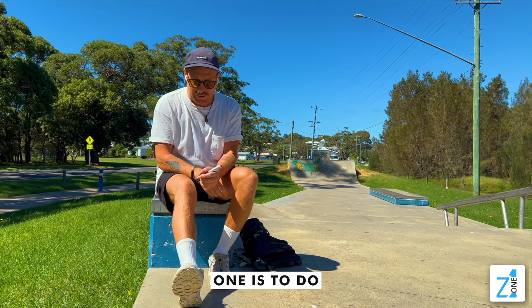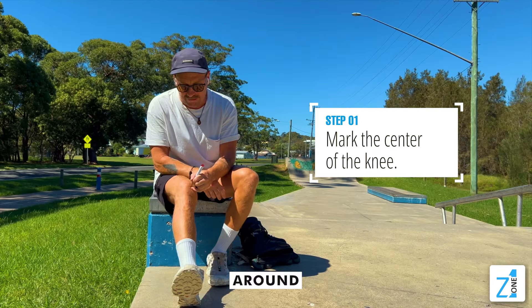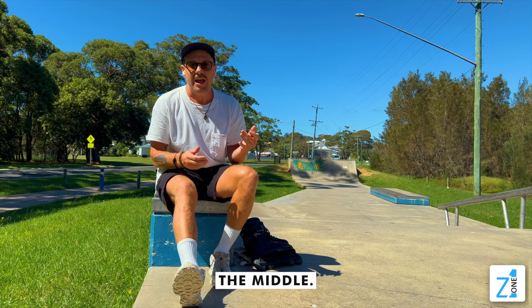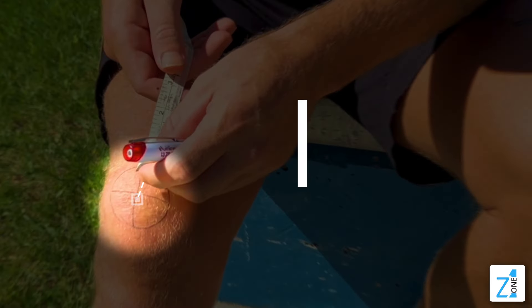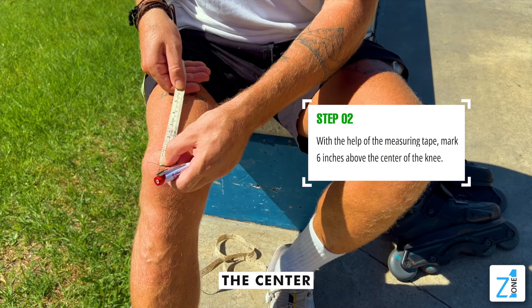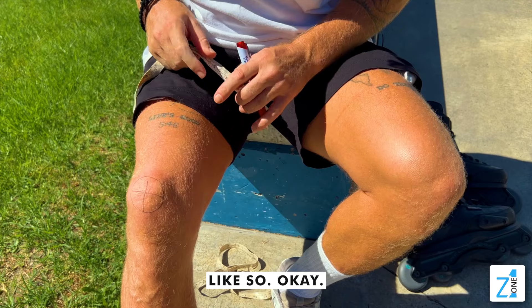Stage one is to do a marking around the center of your knee with a square through the middle. Then what you're going to do is measure six inches up from the center of your knee. Once you get six inches, mark that with a pin like so.